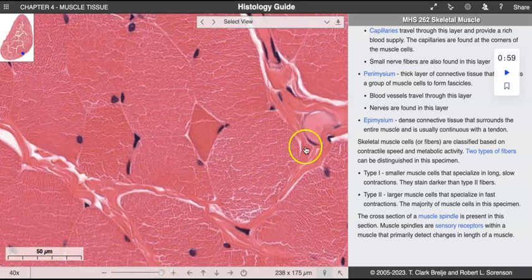You can also compare this back to a capillary, which is this guy. So you can see that there's the simple squamous nuclei. This is maybe one or two simple squamous cells. And that gives you an orientation of size, right? You can compare the size of the muscle cell in cross section to this guy over here. And plus also, look, these are fibroblasts, right? This is connective tissue fiber. So that sizing orientation becomes really, really important.